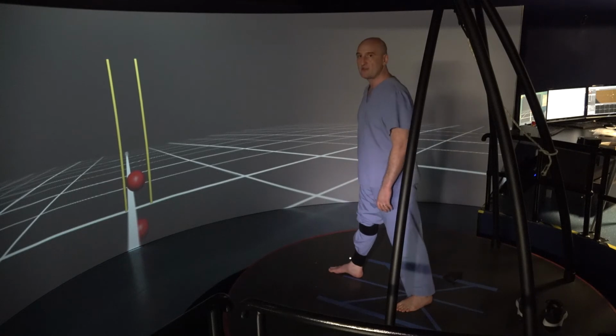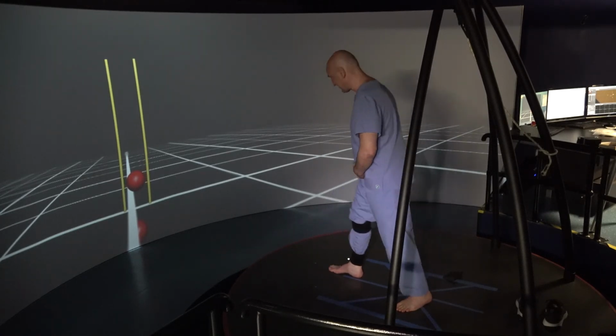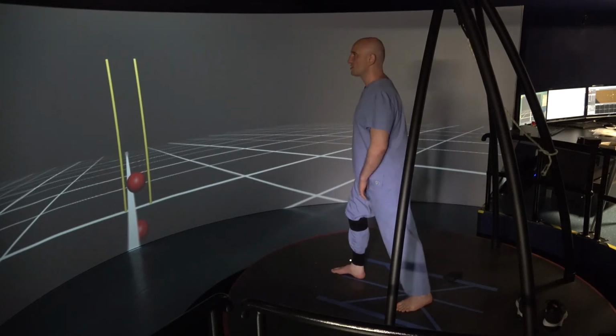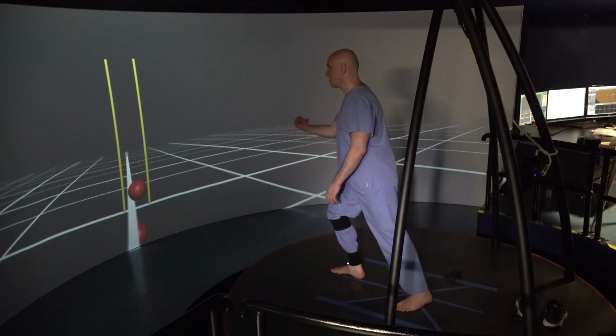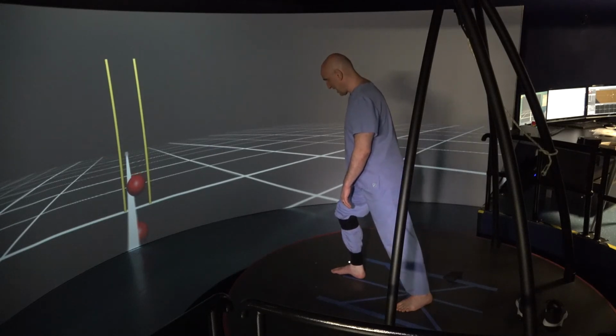Now what looks to me is that I'm going into the valgus, but I'm actually not doing that when I'm walking. I can force it to go valgus, but if I just don't think about it, which is what people do when they move, it's actually going varus. Okay? So this is how we can do it.